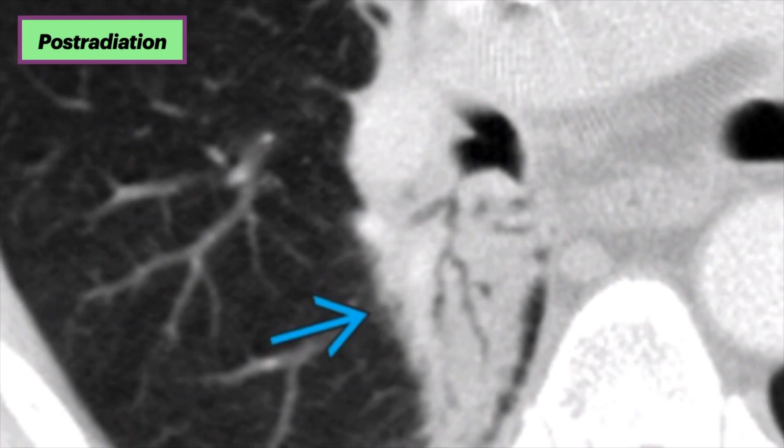We also see atelectasis after radiation. This axial CT in an individual status post radiation therapy for lung cancer shows cicatricial atelectasis affecting the superior segment of the right lower lobe and the medial segment of the middle lobe.